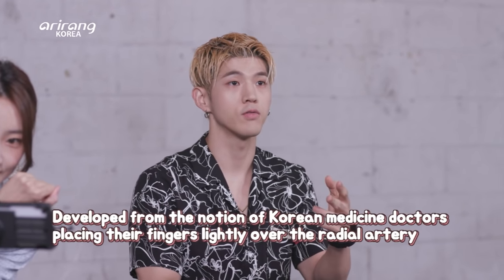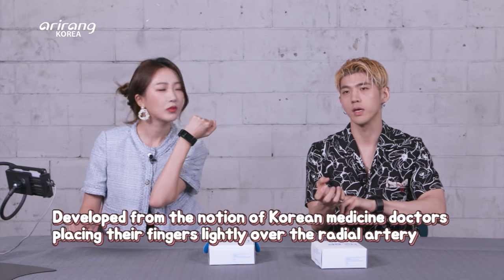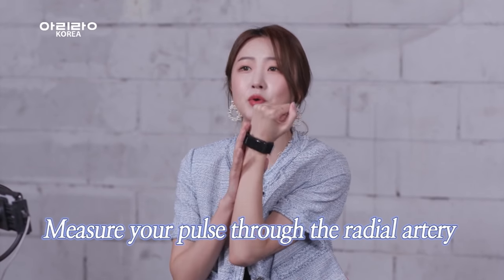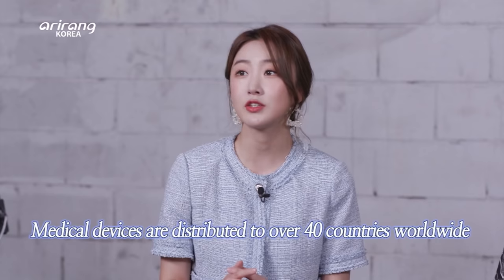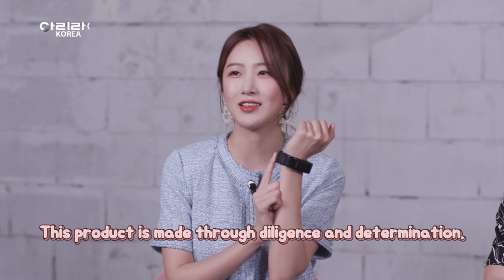Guys, this wristband H2BP was developed from the notion of Korean medicine doctors placing their fingers lightly on the wrist over the radial artery to check the blood pressure. You can get an accurate measurement as you can measure your pulse through the radial artery. Plus, it's the world's smallest and lightest gadget to be graded as a medical device — this is gaining global recognition. Since the company's establishment in 2004, their medical devices are distributed to over 40 countries around the world. This product is made through diligence and determination.